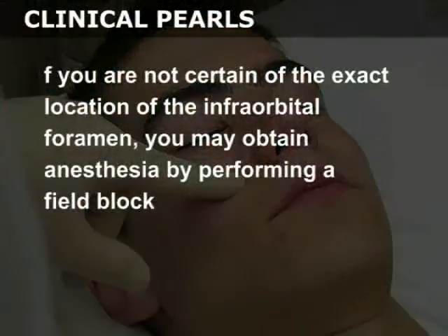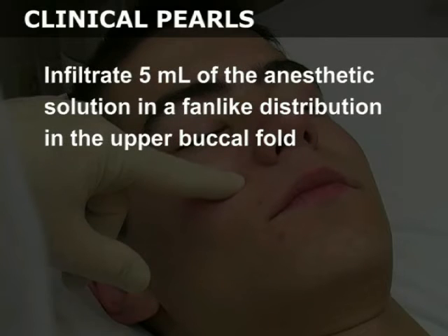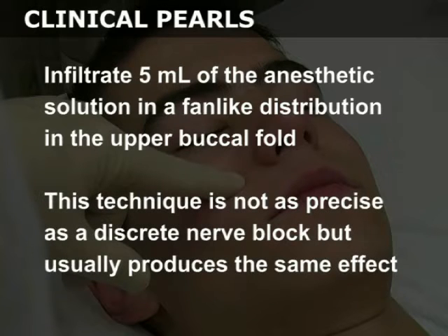If you are not certain of the exact location of the infraorbital foramen, you may obtain anesthesia by performing a field block. Inject 5 milliliters of the anesthetic solution in a fan-like distribution in the upper buccal fold. This technique is not as precise as a discrete nerve block, but usually produces the same effect.